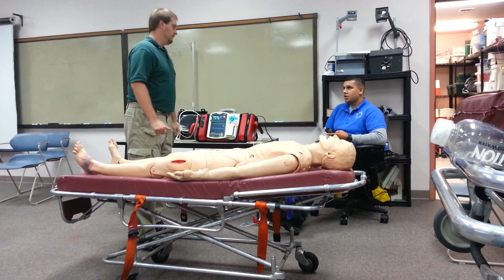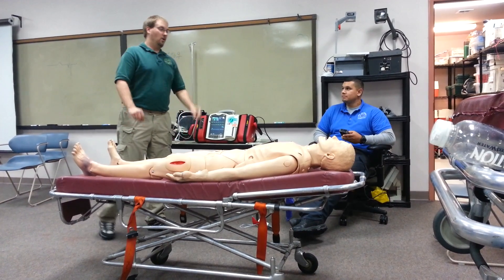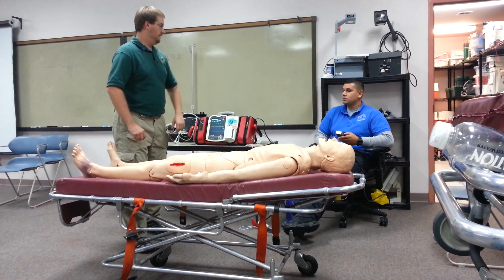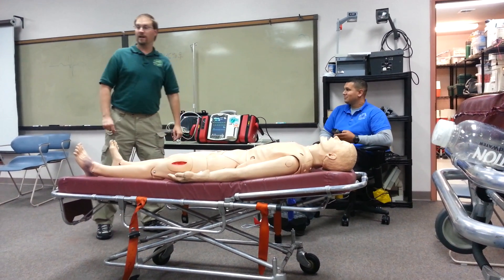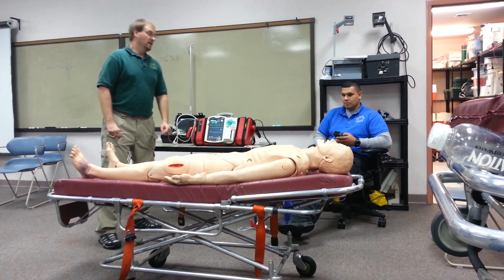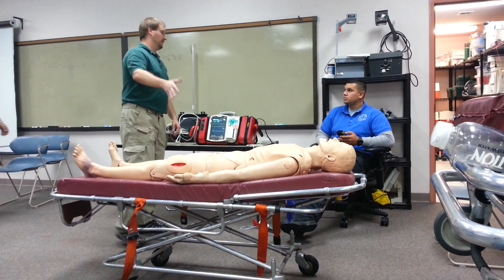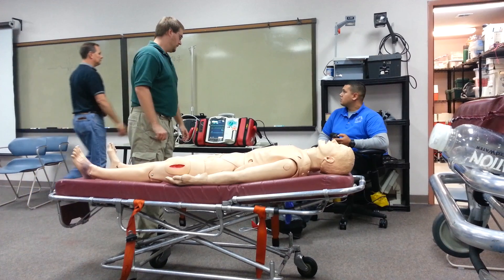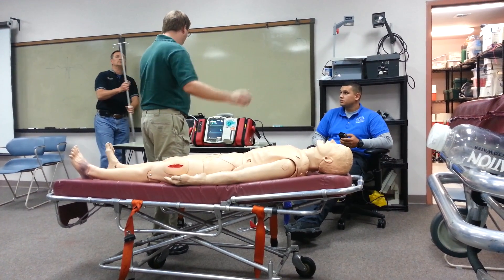The bagging has some resistance. Reposition the airway — still resistance. Let's transition to a supraglottic airway. I want to insert a King LT. How big does this patient look? She's about 130 pounds. Insert a King LT of appropriate size for her weight.